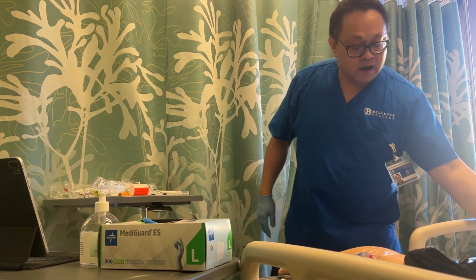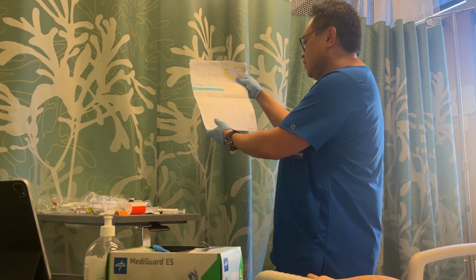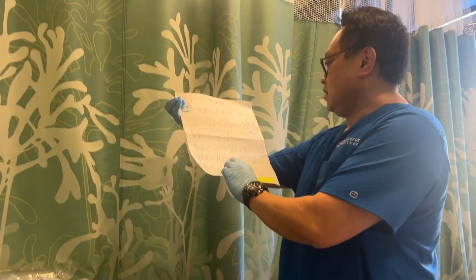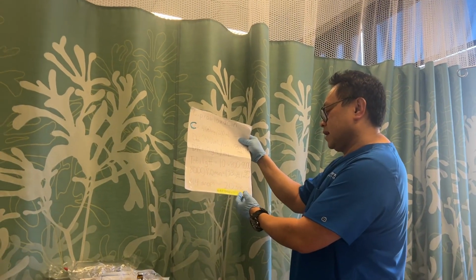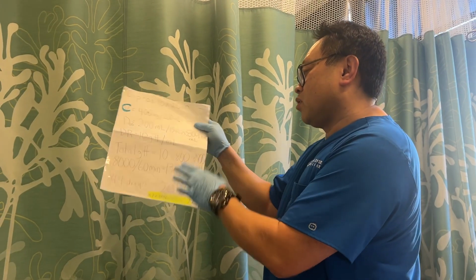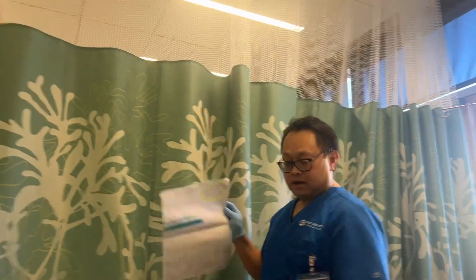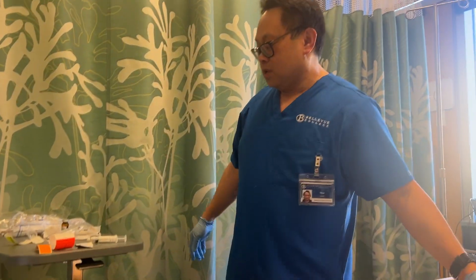Okay, so before I start this, I'm going to talk about our calculations. We're going to get the sodium chloride, 125 milliliters an hour. It's about 7 drops per 20 seconds. And the ciprofloxacin, we're going to give 44 drops per 20 seconds. Maximum dose is 400 milligrams per 12 hours. And there was a discrepancy, but with the ondansetron, 4 milligrams was either 8 or 12 hours. And so you would make sure which one it was for the maximum dosage.